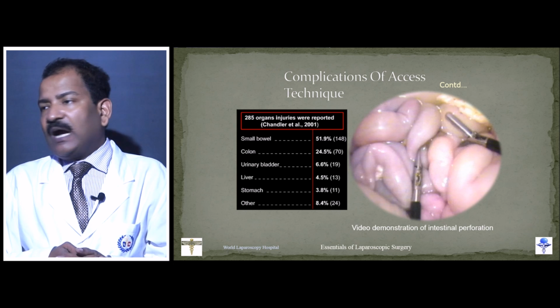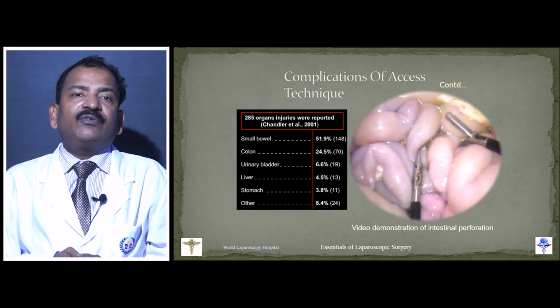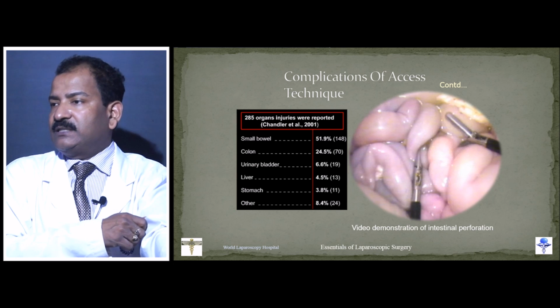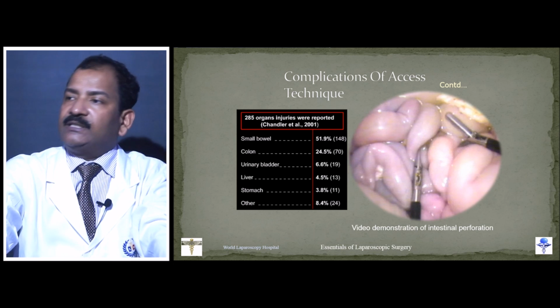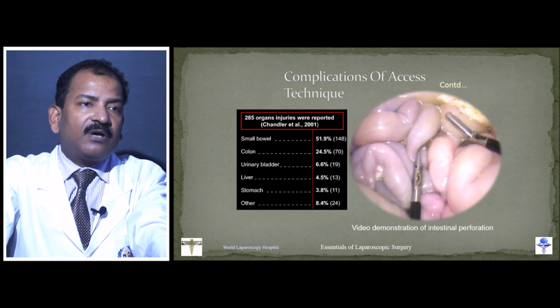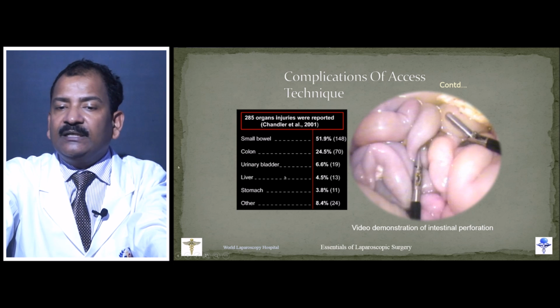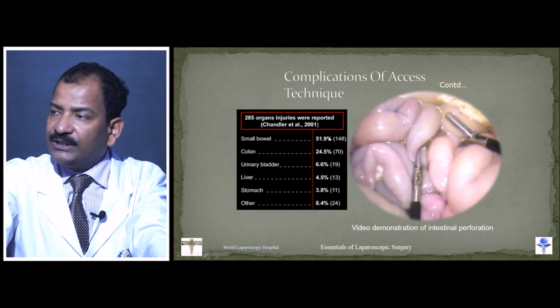After trocar insertion. And if you are a surgeon, then you have to put head up after primary trocar insertion.